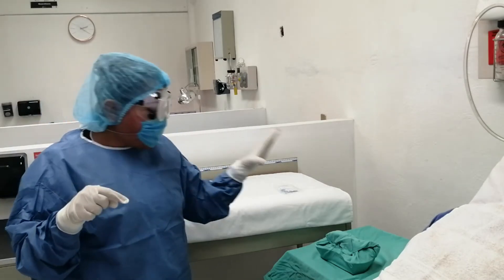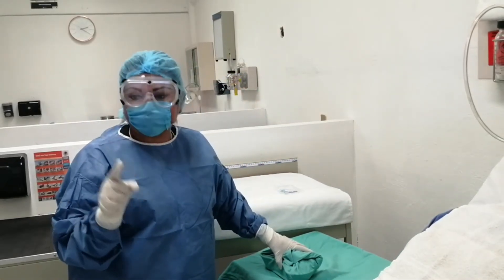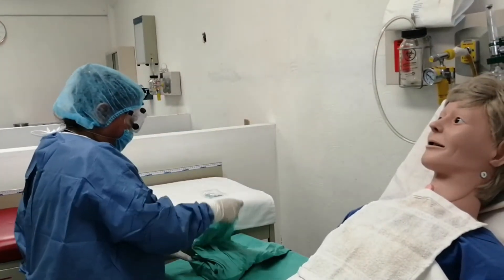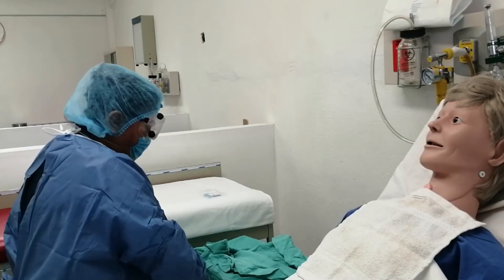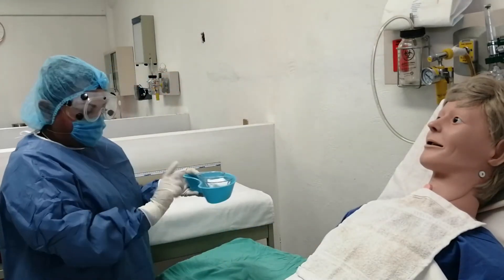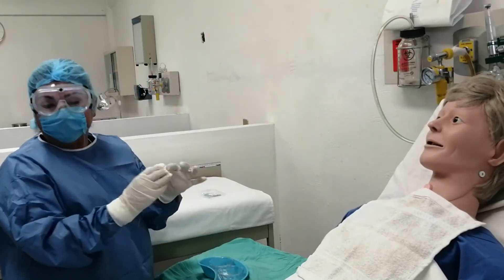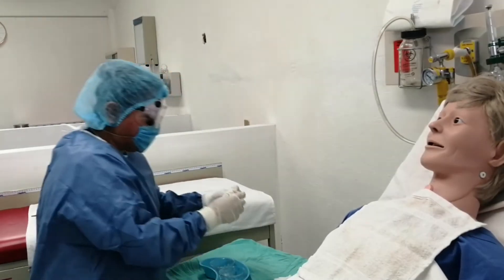Procedemos a abrir la segunda envoltura, la cual según la literatura se puede manipular con guantes estériles o con pinzas de traslado. Con los guantes estériles, abro de igual manera: punta distal, luego la del lado, y finalmente la que está hacia mí. Nuestro equipo está compuesto por un riñón, dos recipientes y unas gasas que ya trae el equipo. Las gasas nos van a ser muy útiles; las sacamos del recipiente y las acomodamos.